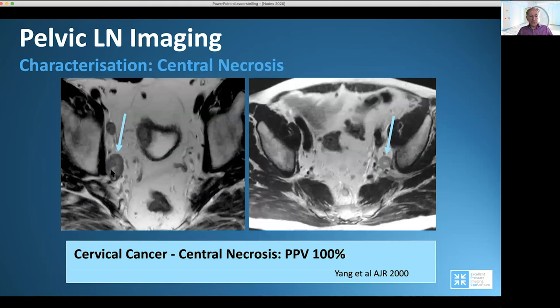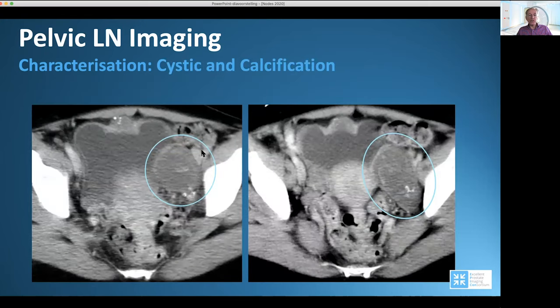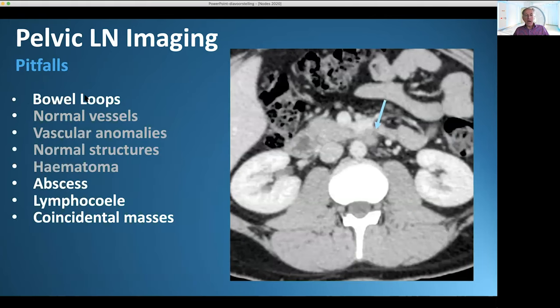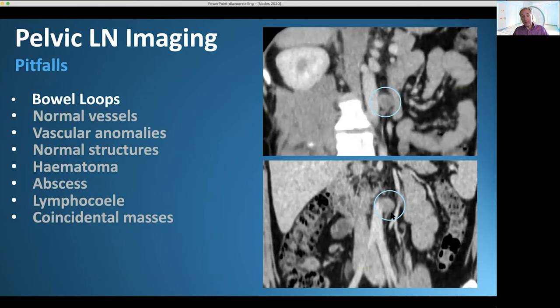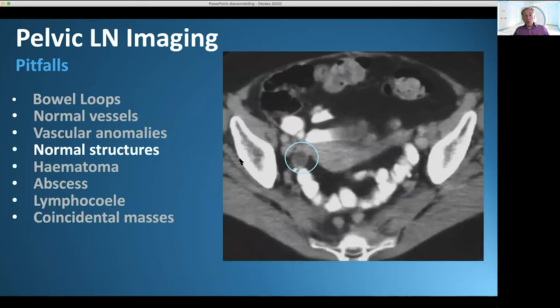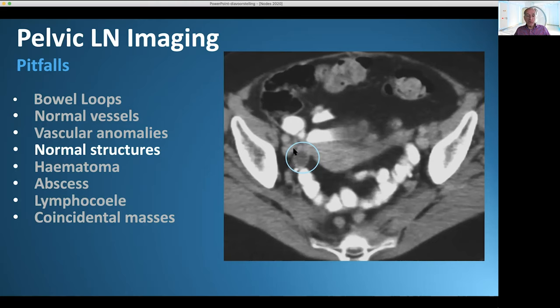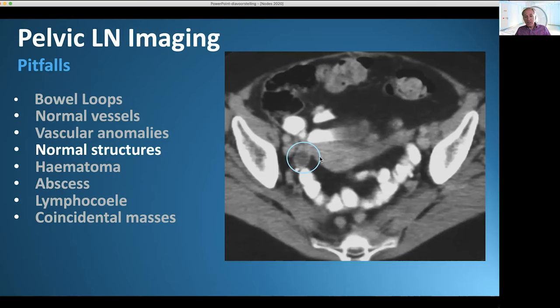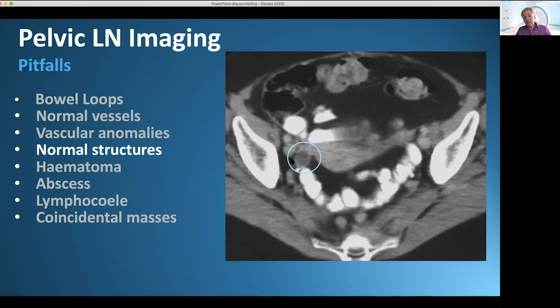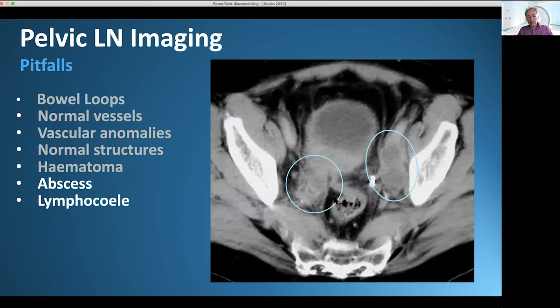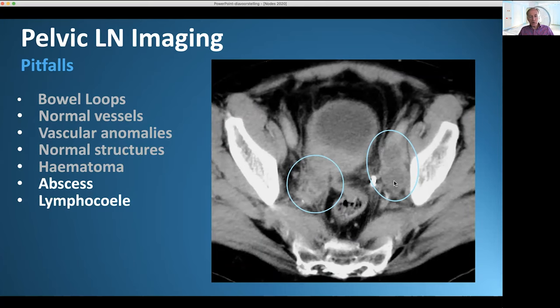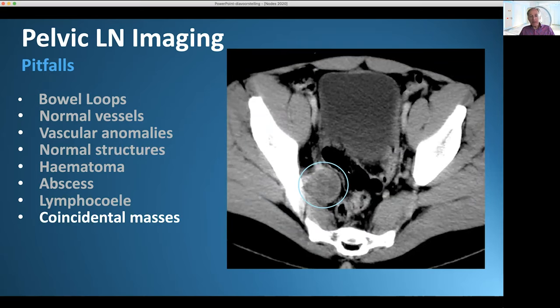Central necrosis is sometimes seen in cervical cancer and is a sign with a very high positive predictive value — those lymph nodes are almost always pathologic. You can also see lymph nodes which are cystic with calcification — they usually are also malignant. Sometimes you have problems distinguishing bowel loops from lymph nodes, but you should just use the other plane. Normal structures can also cause confusion: lymph nodes are outside of the peritoneum, whereas a structure inside the peritoneal cavity — medial to the external and internal iliac vessels — can be a cystic ovary in a female patient. Other false positives include abscess, lymphocele, and coincidental masses like a schwannoma.